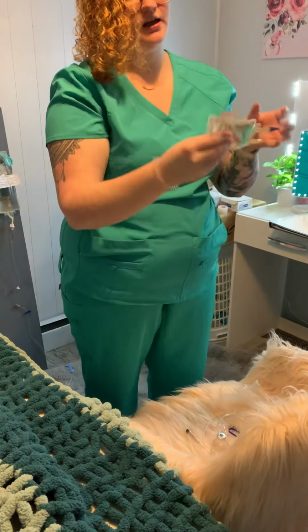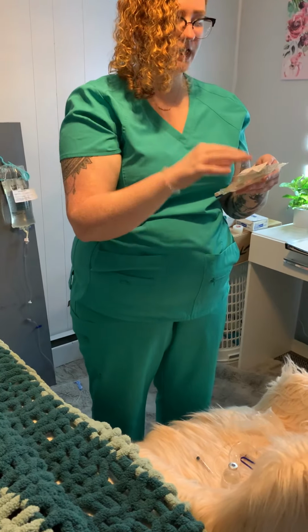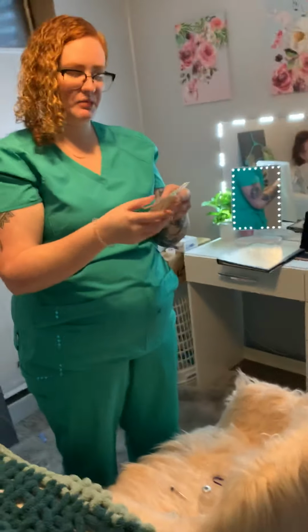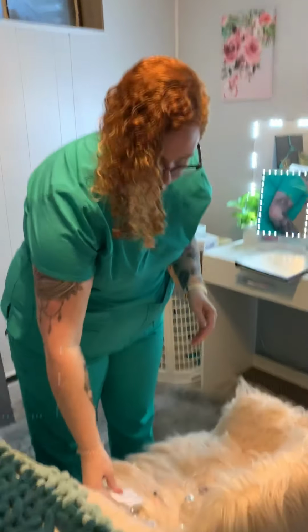And after this medication is injected into the bag, a label will need to be placed on it in order to have it known that there's a medication added to this bag.